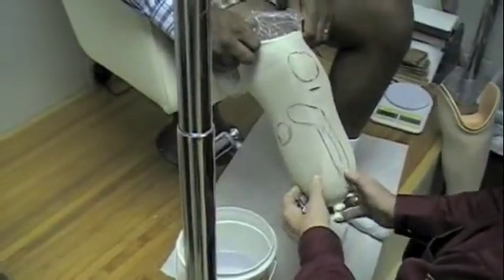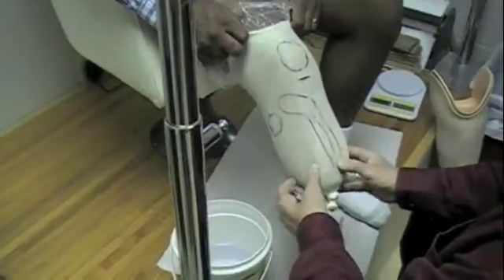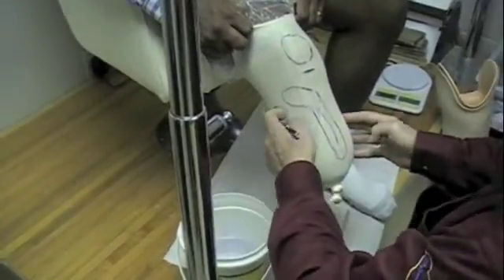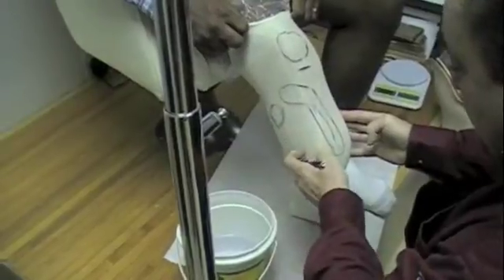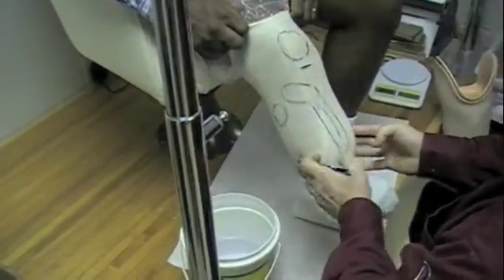If he's got a sharp thing — they did a very nice amputation, by the way. They did a clean job and it's good length, perfect length. Then if there's any bony prominences down here I'll mark them off. This is the fibula head. Now I'll ride down here and look for the distal fibula, and if it's prominent I'll mark that too, but in his case it's going to be fine.